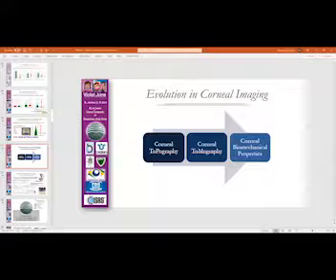Dr. Ambrosio, may I ask something? Sure, please. As far as I understand now, you are combining three modalities of imaging: tomography and biomechanical module. Are you going to combine all of them in one single mathematical module or something? That's the idea.